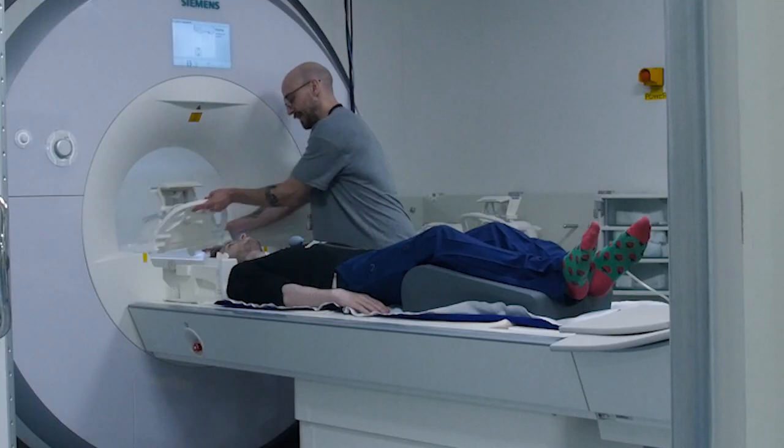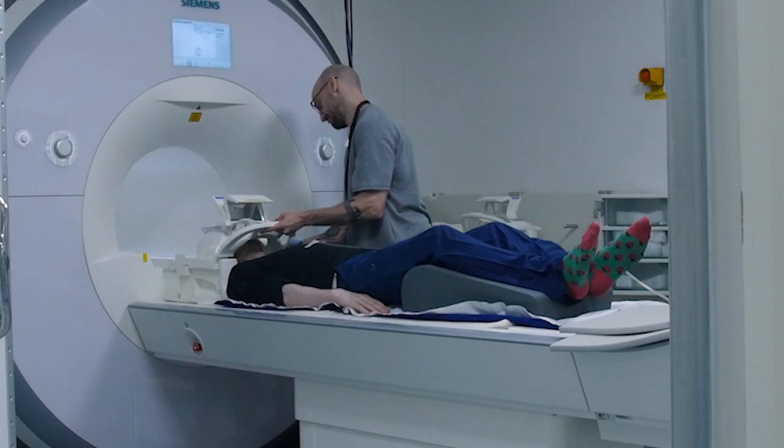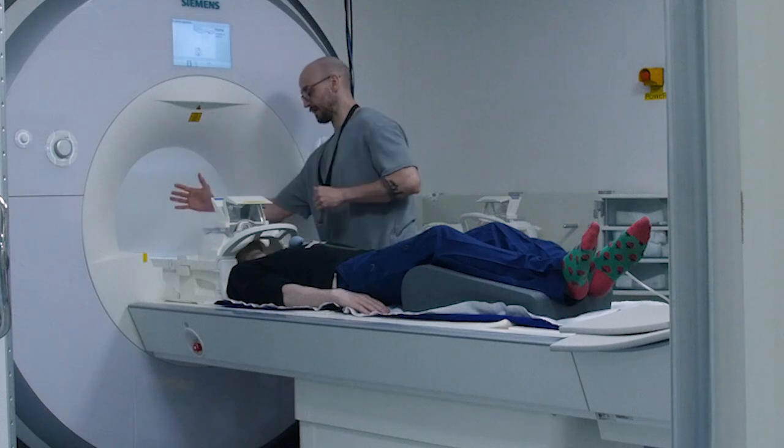The T in an MRI scanner, either 3T for a clinical scanner or 7T for advanced research scanners, corresponds to the strength of the scanner, what's known as the magnetic field strength. So the higher the number, the higher the magnetic field strength. What that means for us is that the higher the magnetic field strength, the more signal we collect, and we can use that signal to make the images better. We can increase the resolution, make the detail of the images higher, or we can make the scans quicker so that the subject doesn't have to be in the scanner for so long.